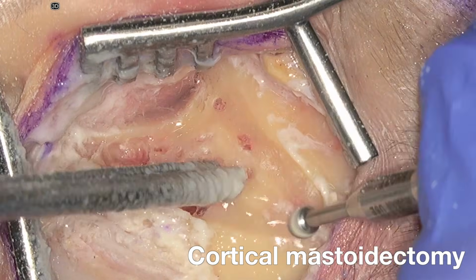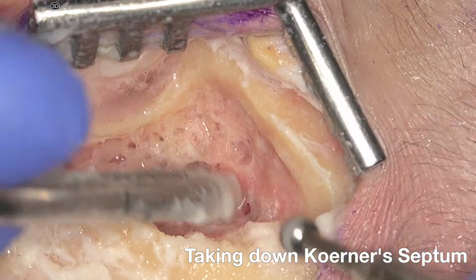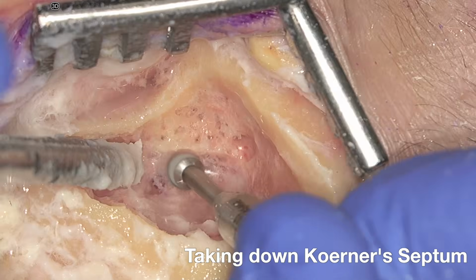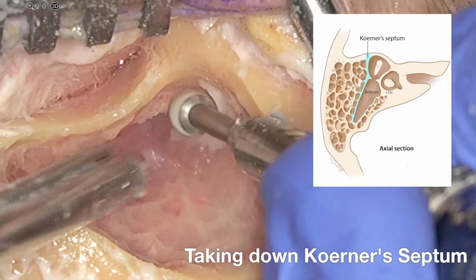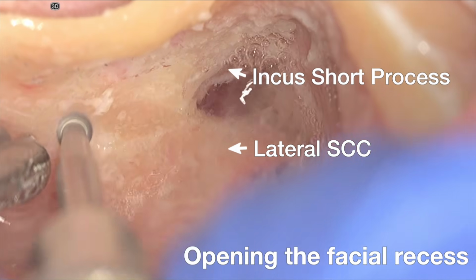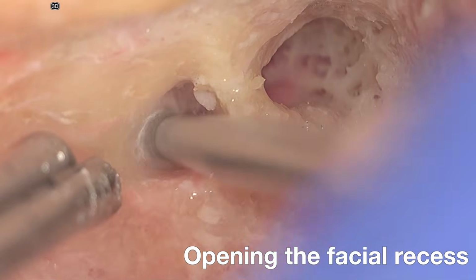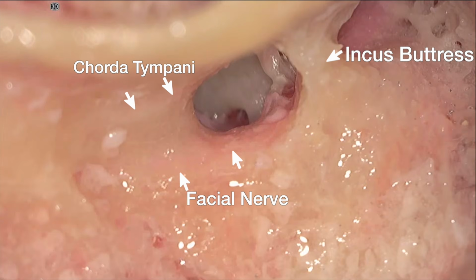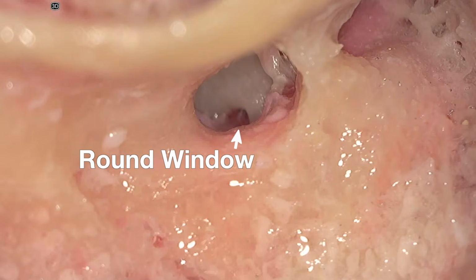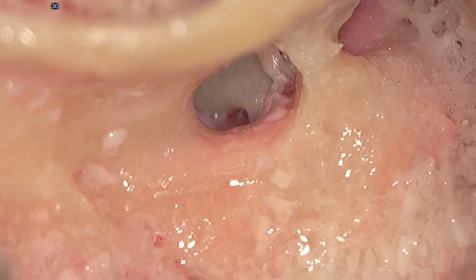A cortical mastoidectomy is performed and Körner's septum is taken down to identify or open the antrum, where you can identify the lateral semicircular canal and short process of incus. Then you can start opening the facial recess between the incus buttress, facial nerve, and chorda tympani nerve. This allows you to visualize the round window membrane where you're going to place the electrode.